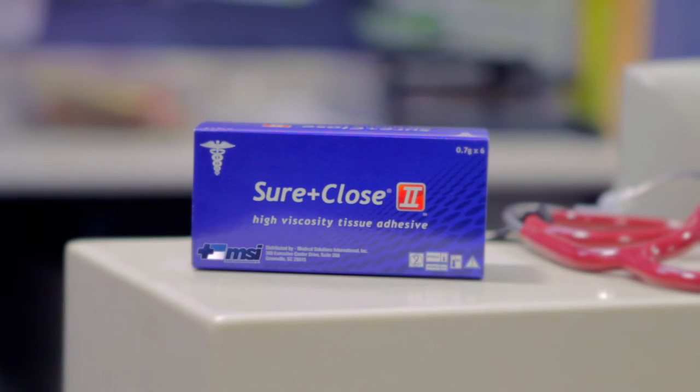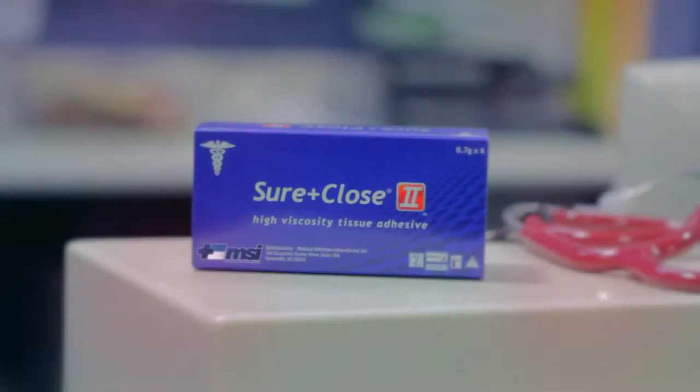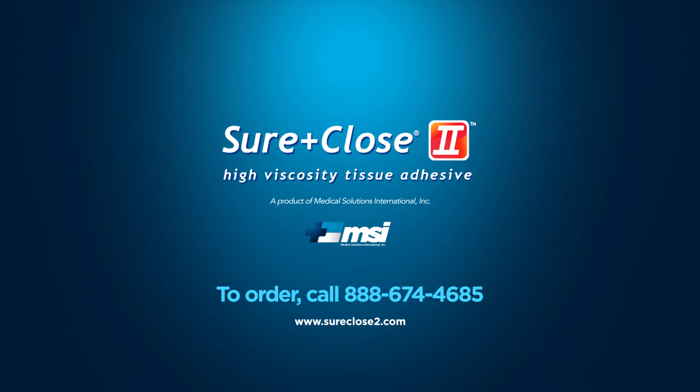Sure Close 2 High Viscosity Tissue Adhesive offers features and benefits that include a waterproof and microbial barrier, 60-second drying time, flexible hold, no sting or burn when applied, multiple wound applications, and it's easy to apply. To learn more about Sure Close 2 or to place an order, please contact your Medical Solutions International representative today.